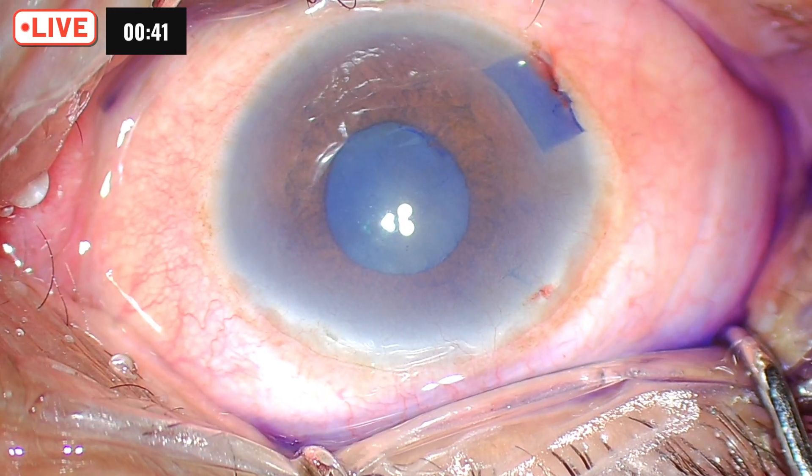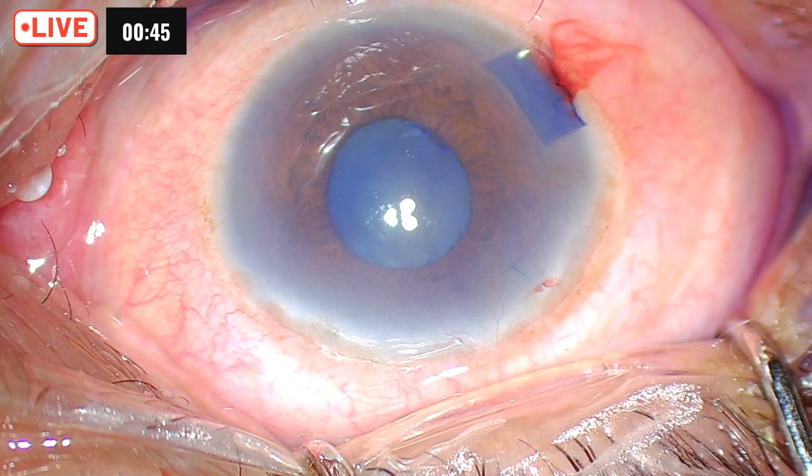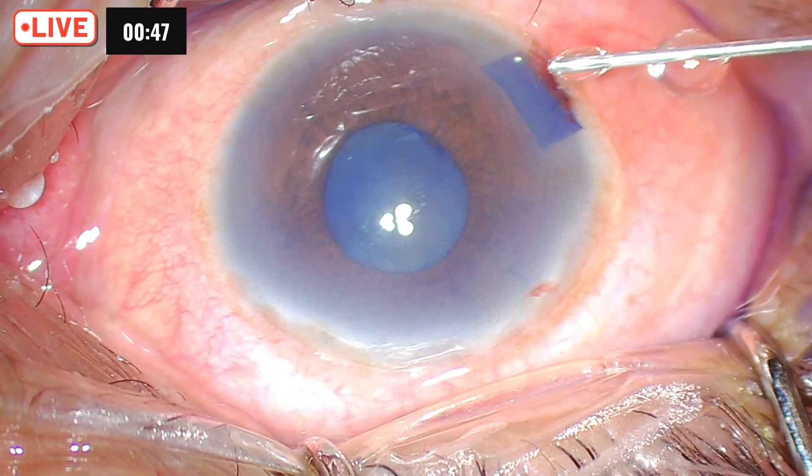Otherwise, you will only stain the visible area of the capsule. So we applied adrenaline. Now we have stained the capsule well — that is the first requisite here.